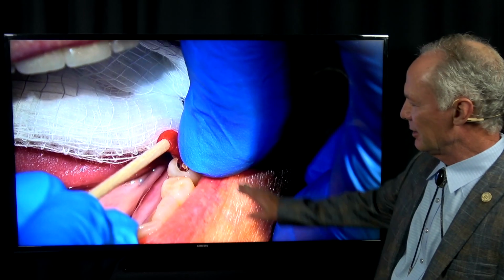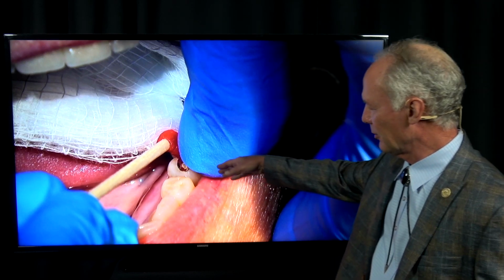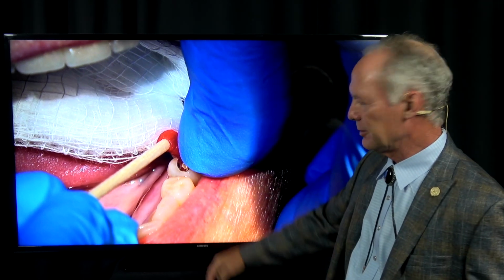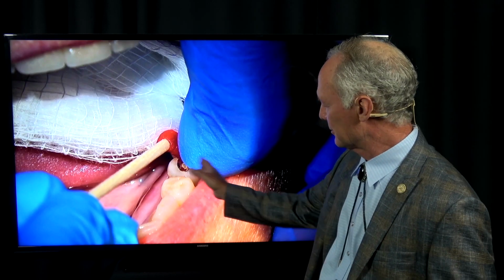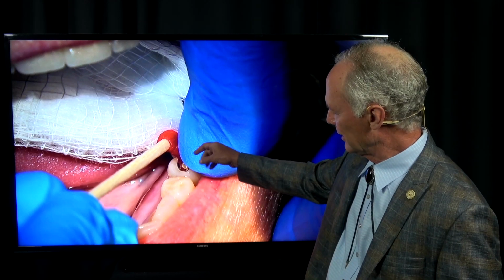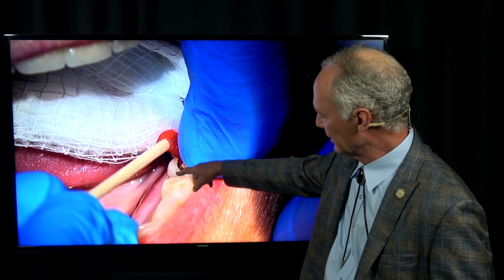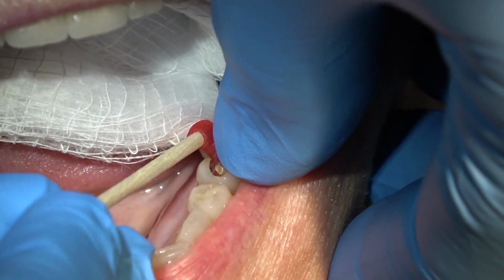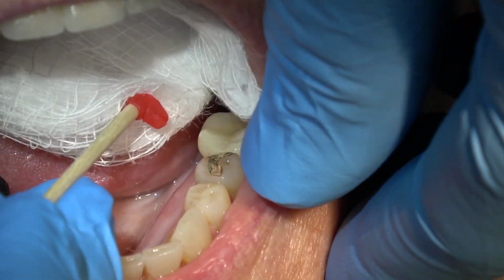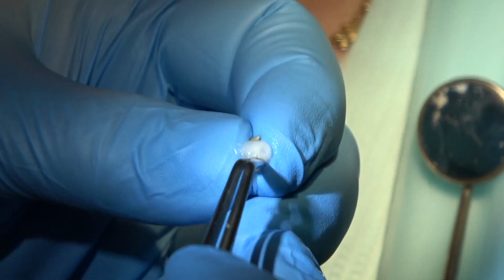Now, you don't want to place an inlay if there's not good solid tooth structure all the way around it. I don't ever place an MOD inlay. In that case, it would be an onlay or a full crown, because you don't want the patient to bite and split the tooth. So this is when there's lots of good tooth structure all the way around the inlay, including the other mesial or distal area. I don't ever place MOD inlays. See, there's lots of tooth structure around it, so I'm not worried about a tooth fracture.